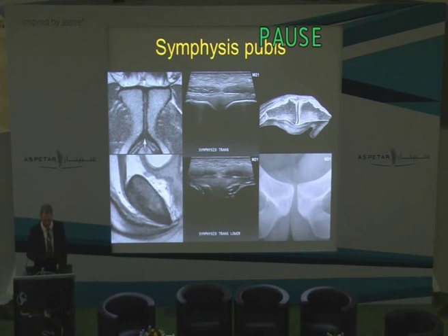What this means for ultrasound is that the more anterior and superior structures, I'd say the upper two-thirds of this construct, are well visualized by ultrasound, but the deeper portions here that are becoming more vertical to the skin surface, more vertical to the beam, are poorly resolved. So we don't see well the arcuate ligament, but we do see well the anterior pubic ligament.